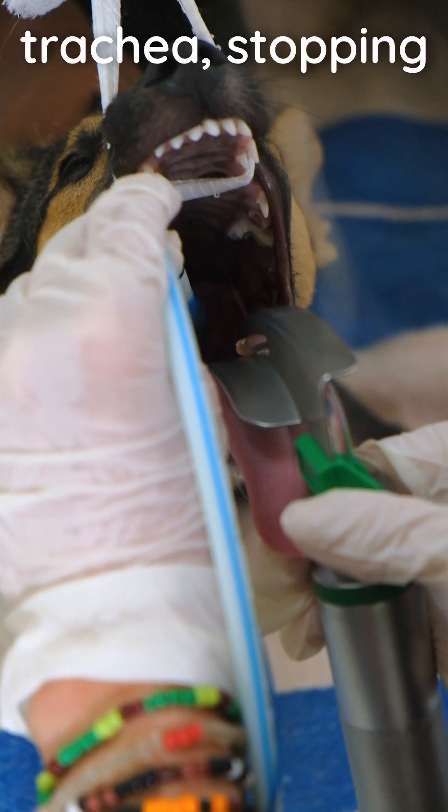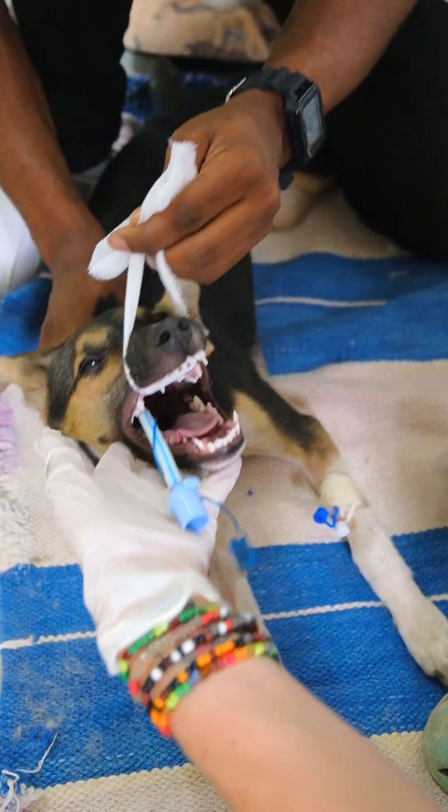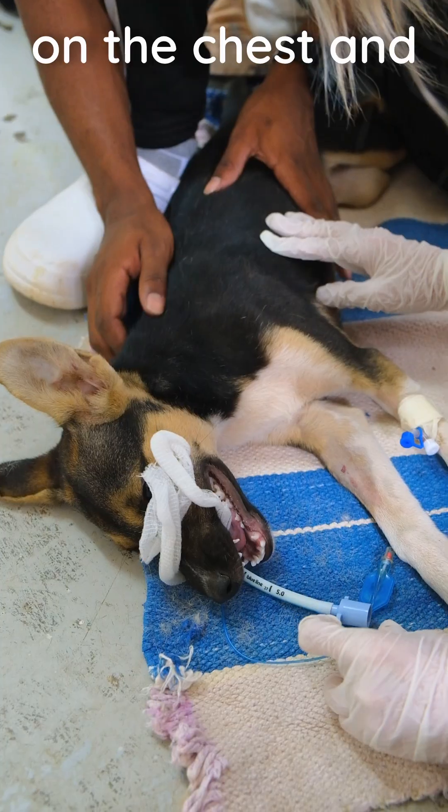Pass the tube into the trachea, stopping at the pre-measured point. Confirm placement by checking the tube for breath; otherwise, you may gently press on the chest and feel for breath.